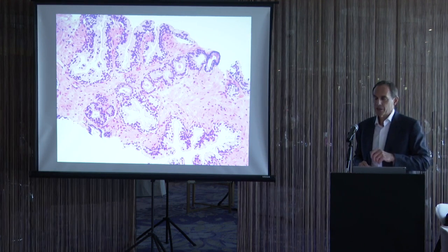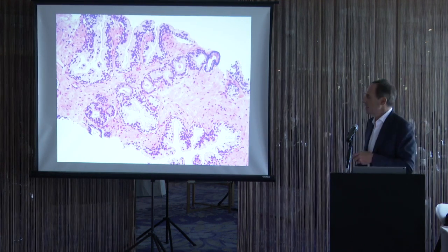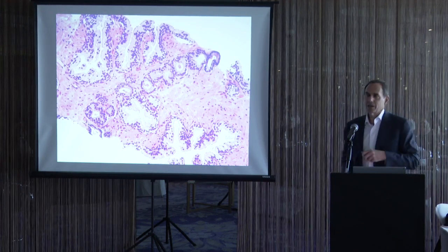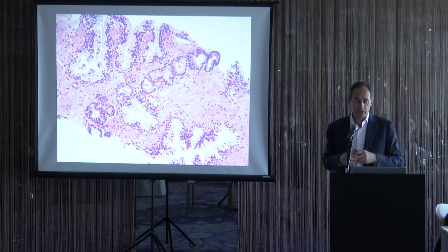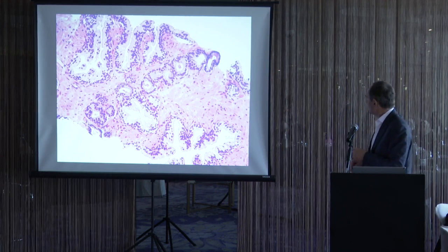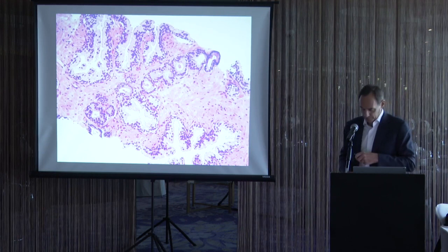The final architectural pattern that's good for prostate cancer is a linear array of small atypical glands going across the core. That is not an anatomical pattern of benign glands, this linear growth pattern. You can also appreciate that these glands have darker cytoplasm relative to the benign glands.